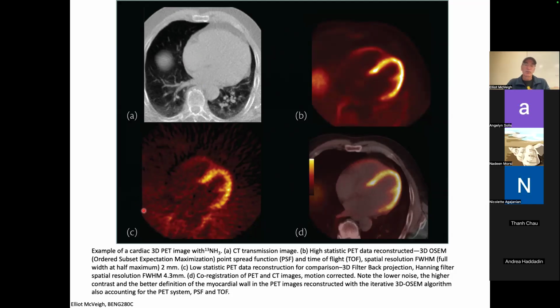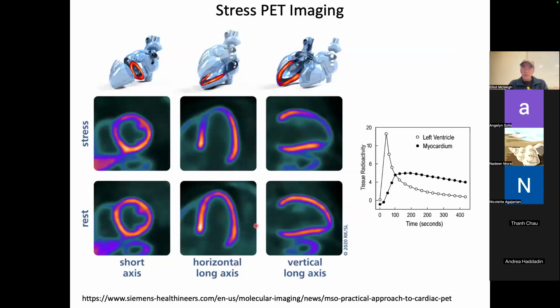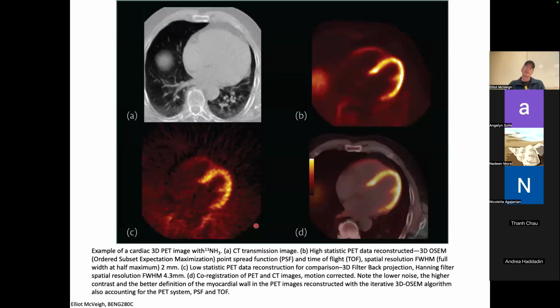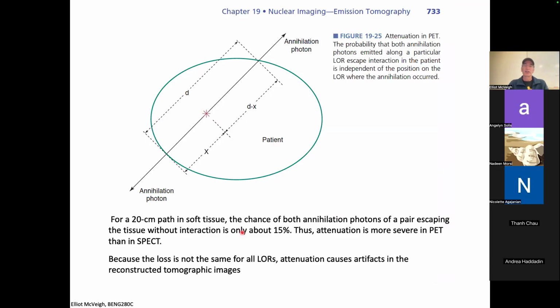Here's the raw, I don't know, it doesn't look like I'm looking at the projection method. We'll talk about that in a minute. So this is a PET image from convolution or 3D filtered back projection, okay? And what that means is we take all of our list data.